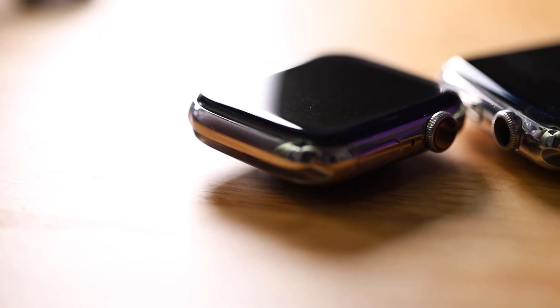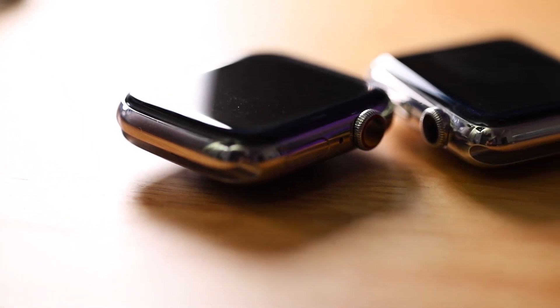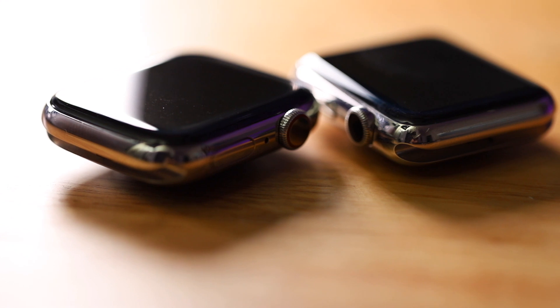All in all, the ECG functionality was one of the main features that really set the Apple Watch Series 4 apart from previous versions, and until now it wasn't available. Now that it is available, to me it makes it really clear that the Apple Watch Series 4 is definitely an A-plus, must-get device. If you're trying to decide between the Series 4 or the Series 3 because it's a little cheaper, I would definitely lean towards the Series 4, because in the several months I've been using it, I'm super impressed with it.